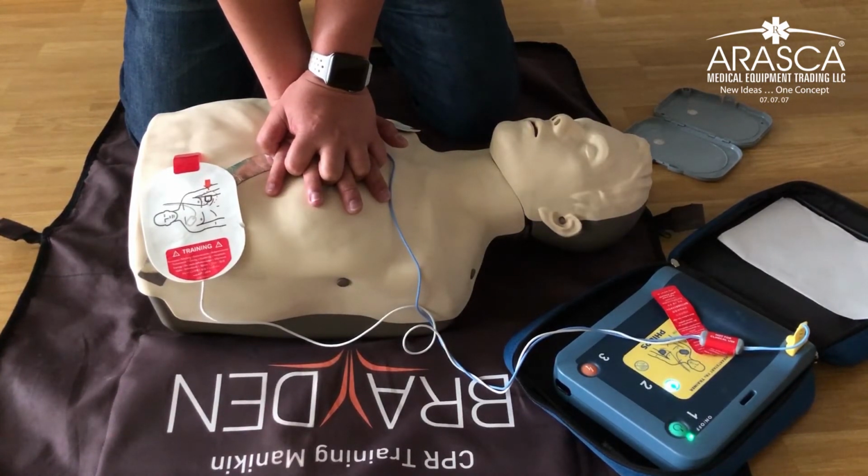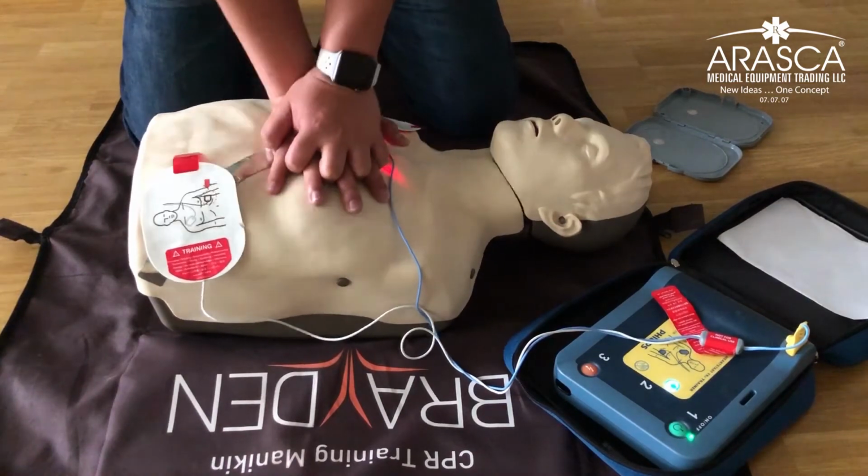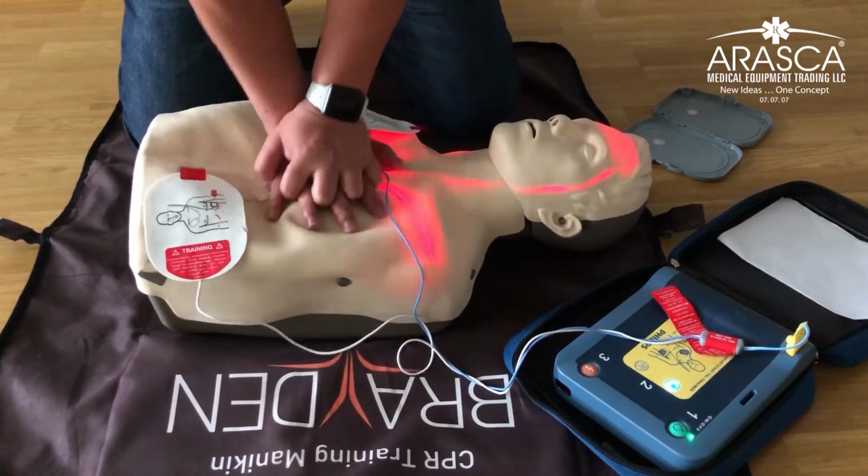Push the chest down firmly 5 centimeters. Keep time with the beat.